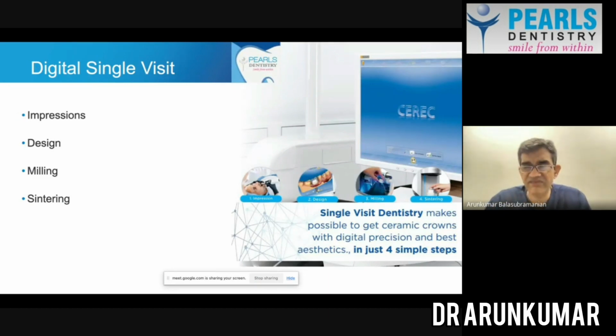And when I mean by single visit dentistry, there are 4 critical steps. So what are those 4 critical steps? The first step is making an impression. In this impression, we use a digital method to make an impression, which I will be showing an actual demo of how this impression is being made.